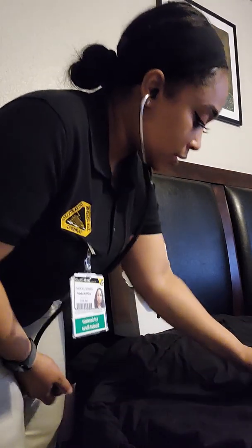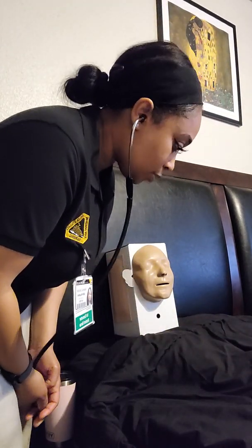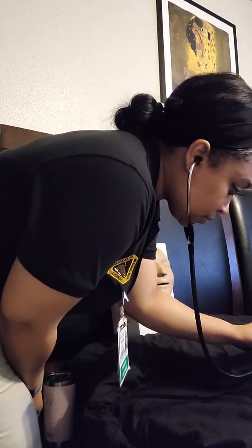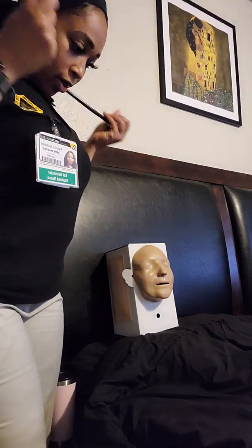So first I want to take a look at your stomach. It's a little distended, which is to be expected because of your bowel obstruction. Now I'm going to take a listen. All right, minimal bowel sounds, which is also to be expected. Okay, so now we will go ahead and get started.